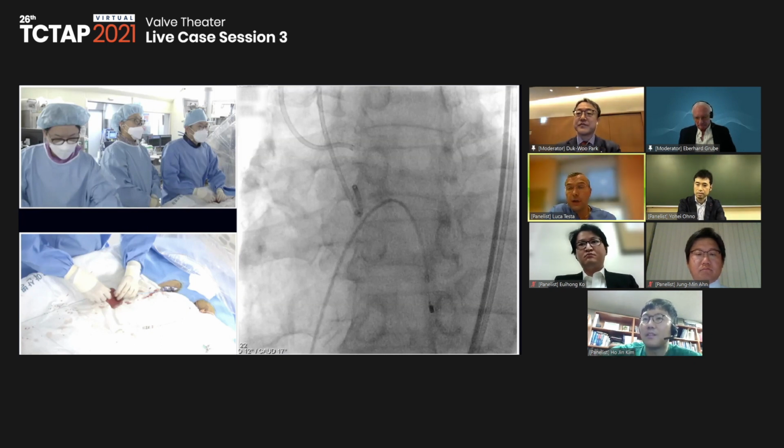If this is not enough, we do an angio with 10 milliliters of contrast just before, in the same setting of the TAVR, just to confirm that we are proceeding in the right way. If you look at the calcification only, you can have a lot of information anyway. Of course, you don't have enough information about the lumen, that's for sure. Our practice is to have radial access for the protection of the main axis. So from the radial, you can just inject 10 milliliters and you have all the information you need.